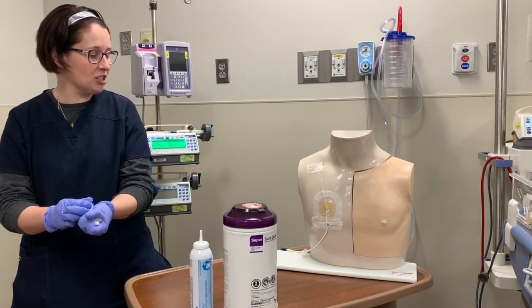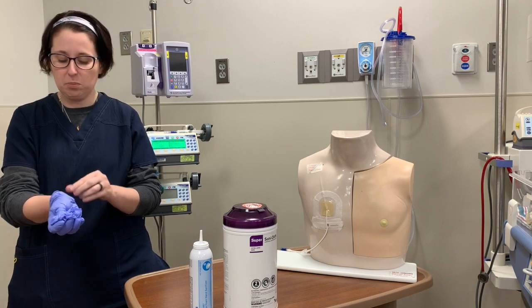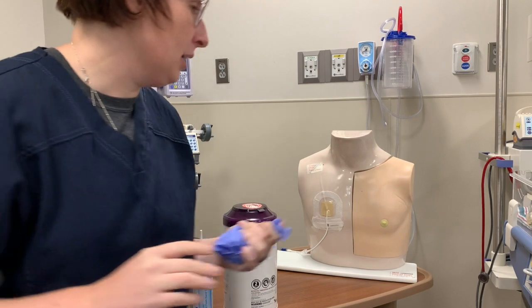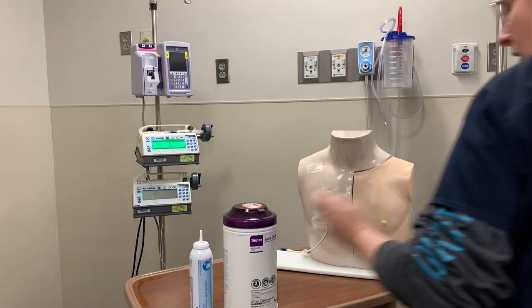Hi there, friends. I just finished cleaning my workstation so that we can get a blood culture from this febrile patient. I'm going to take off my gloves and gather supplies — I'll wash my hands to go outside the room and get everything I need.